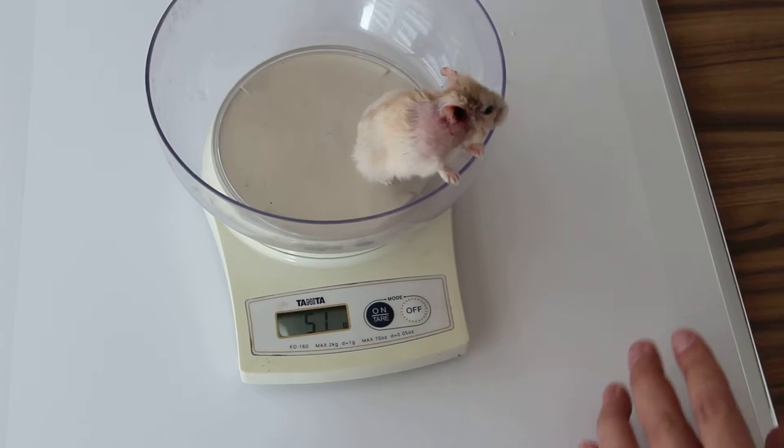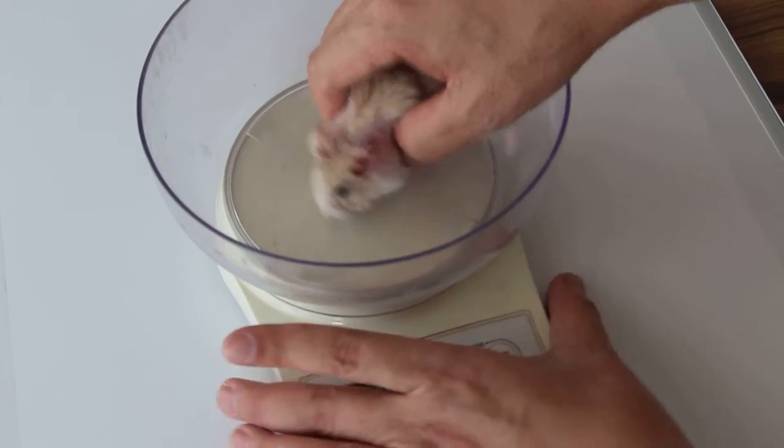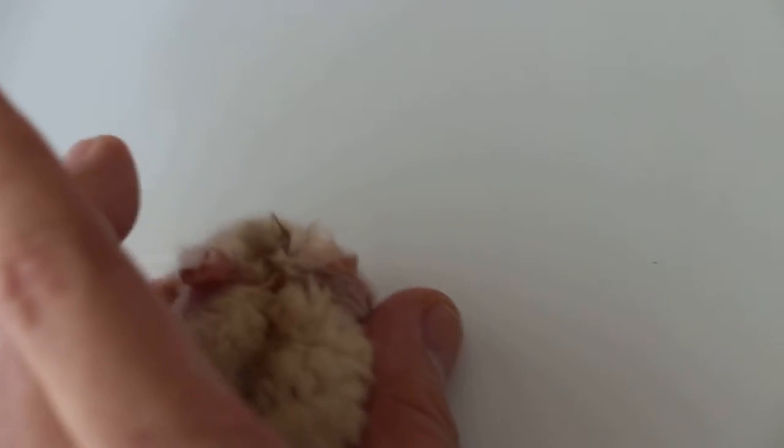Now the cleaning of the ears — the blood must be done because the hamster will lick it and then he may get wet tail. So for this cleaning, normally we use chlorhexidine with cotton, and after that we use plain water to clean off the blood.